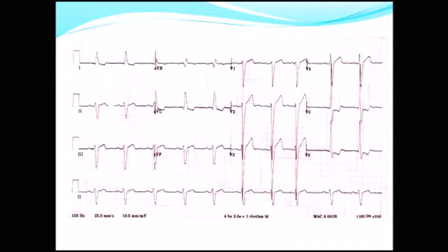But my point about V1 and V6 having the upstrokes, remember, that's how you remember which one's which, yeah? Don't just remember V1, big R wave, you know, McDonald's. Someone told me, for bundle branch blocks, if you put an M here, McDonald's is on your right-hand side, so therefore right bundle branch is M or something like that. Just remember things how they should be.